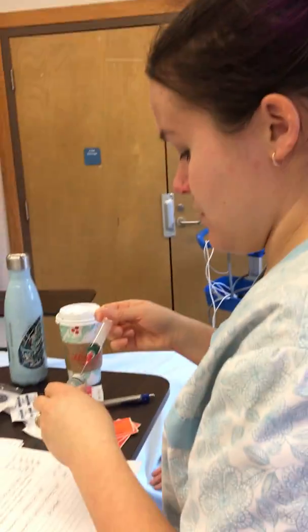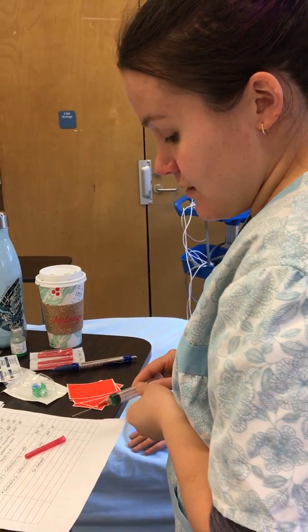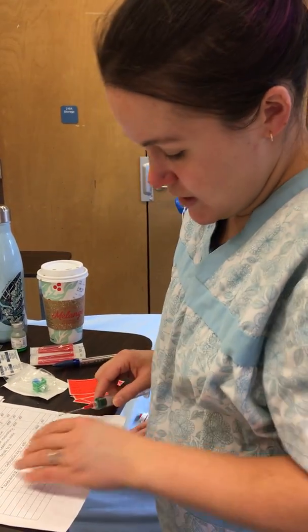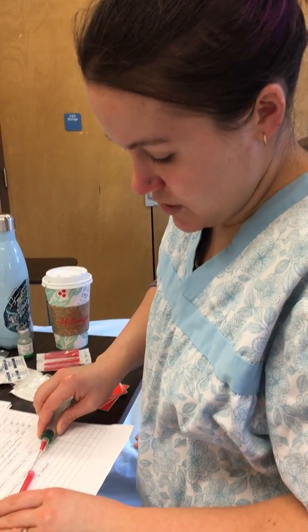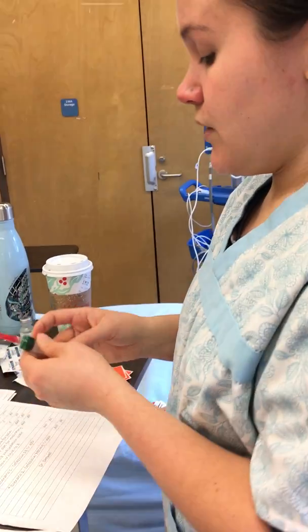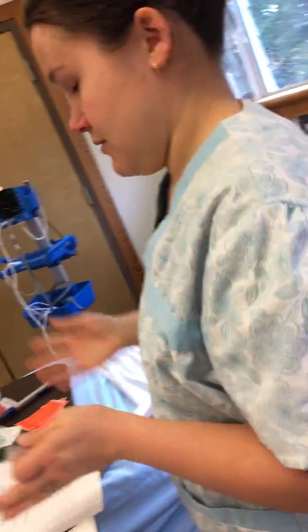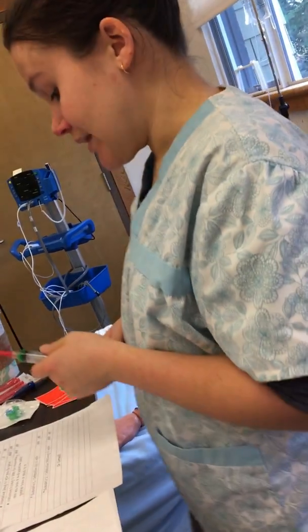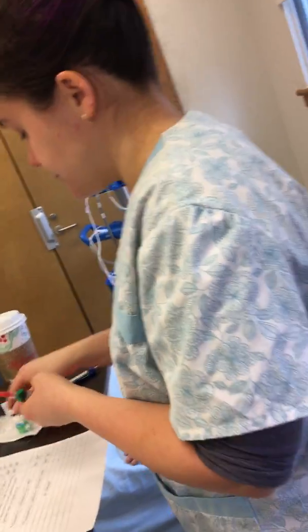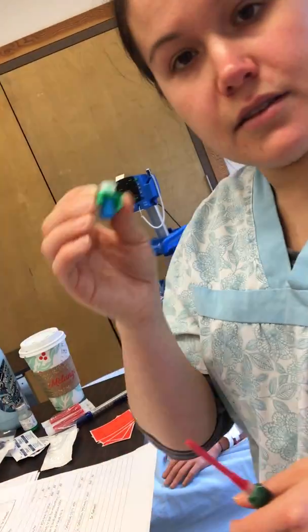Okay. So now I'm going to do the one-handed recap. I have such a hard time with the one-handed recap because I don't have a steady hand. Okay, so now that I've drawn that up, I'm going to do my second check, 7 rights. Okay, I'm done my second check. Now I'm going to get my thingy-majigger.